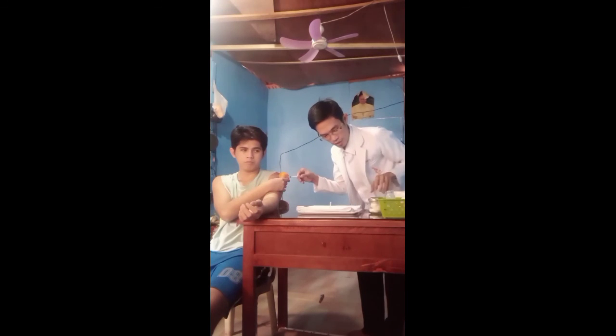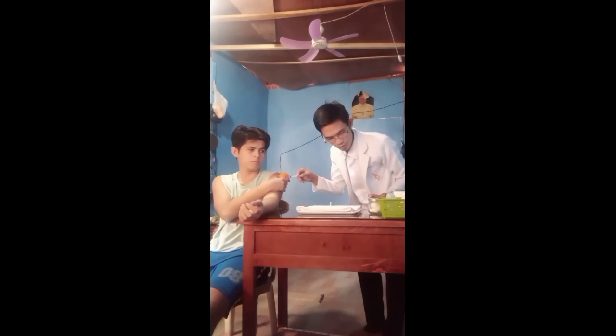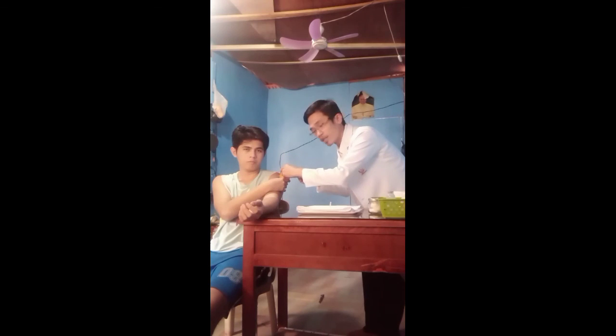Okay, you need to get an alcohol swab for after removing. After releasing, this allows the medication to absorb into the muscle. Withdraw the needle while applying an alcohol swab or gauze gently over the site to minimize discomfort.